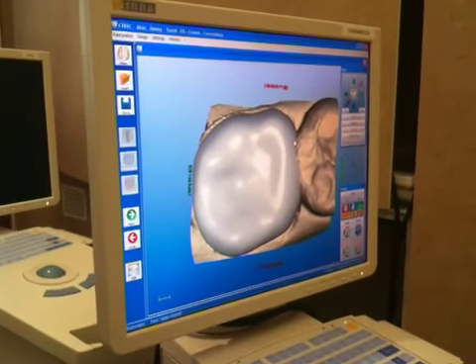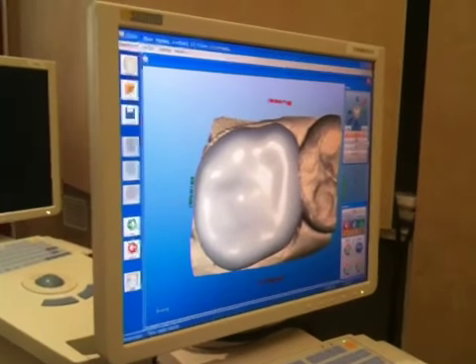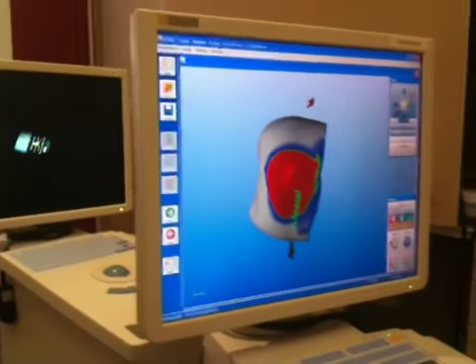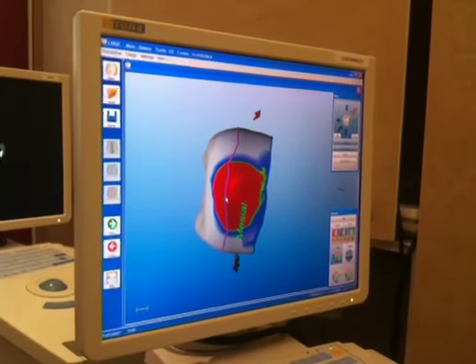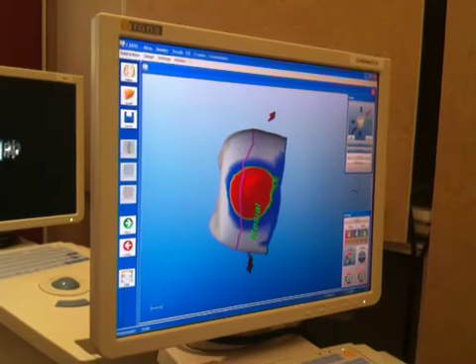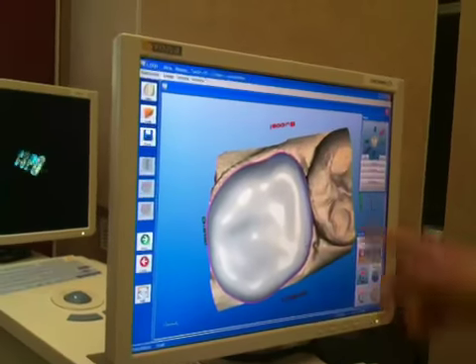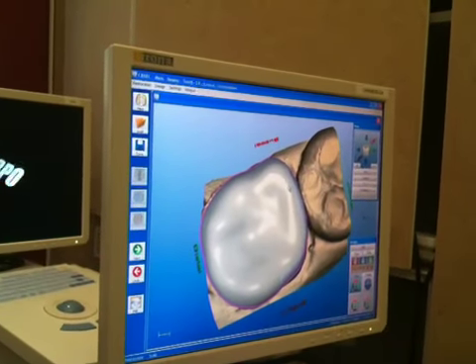Okay, and in this particular area, I'm still a little bit too much into the next tooth. So we trimmed it away, we tilted it on its side here, and now this red contact area tells us that we're touching too much. So I'm going to highlight this half of the tooth, and we're going to move all of it in. You're shrinking away the surface of the tooth. Not the whole tooth, but just that side, the portion. Yeah. And if you notice now, it looks like we have a very nice contact.